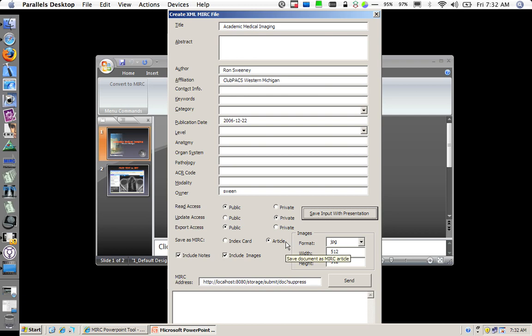I want to save it as an article. I want to include all the notes and all the images from the PowerPoint presentation. I want my image format to be a JPEG.